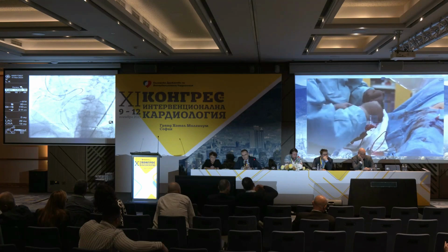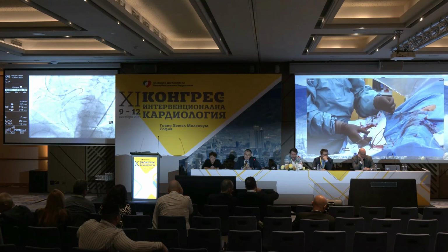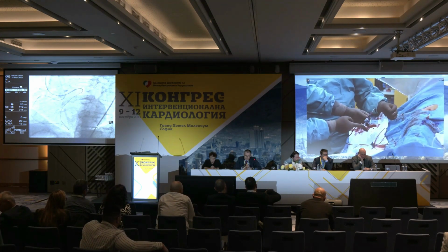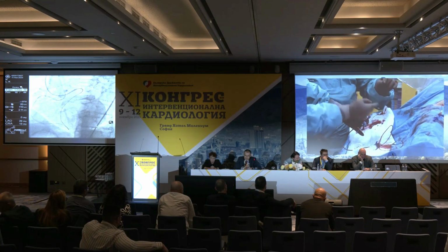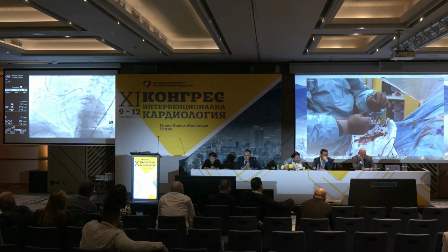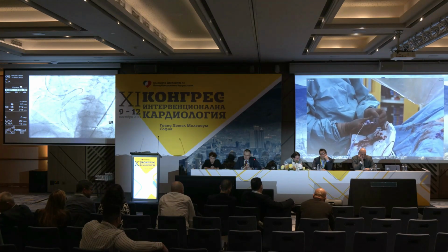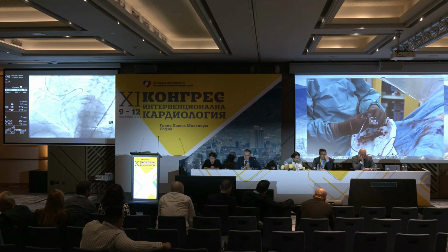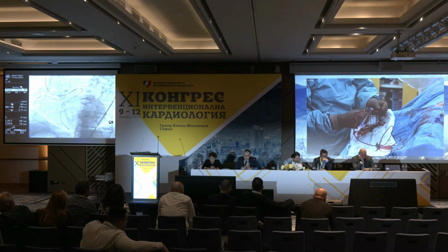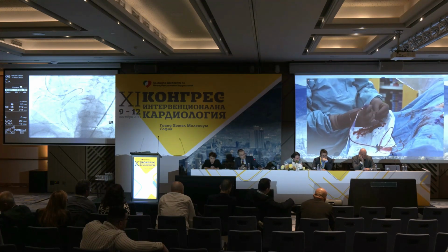As Dr. Gelef is doing the externalization here, let's focus on that, and I will show you what we did. So we have the Y connector, we have the needle, and Dr. Gelef has in his hands the RG3, and essentially the way to do the externalization is that you use the RG3, you insert it into the needle, and then essentially the externalization is finishing.